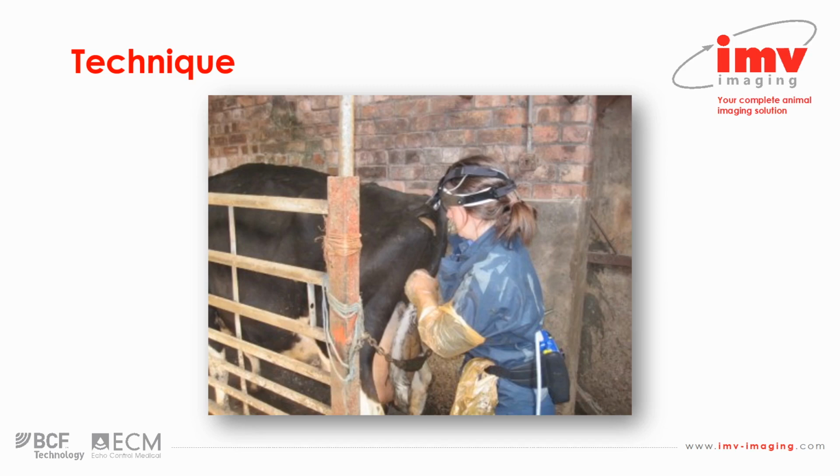Then we've got some kind of mechanism to stop the animal shooting backwards and squashing the technician or the veterinarian, in this case a chain, maybe a bar there, and then you're free to take hold of the animal's tail, obviously wearing adequate personal protective equipment here in the form of waterproof coveralls and arm length gloves.